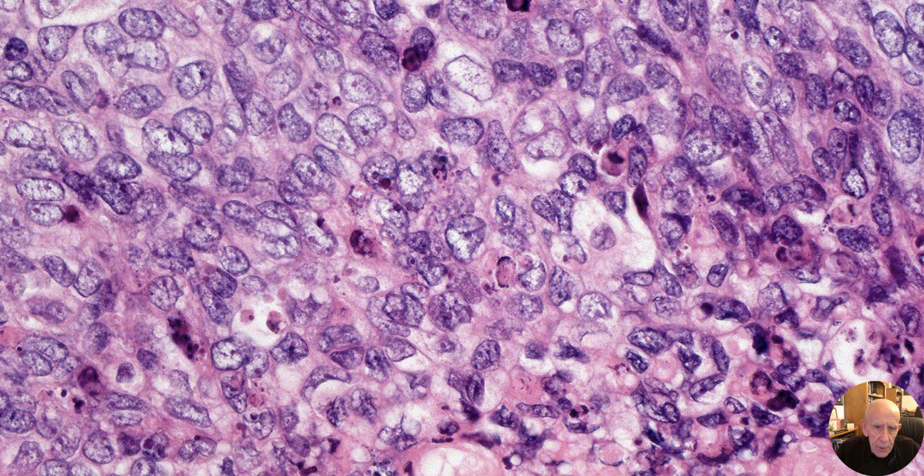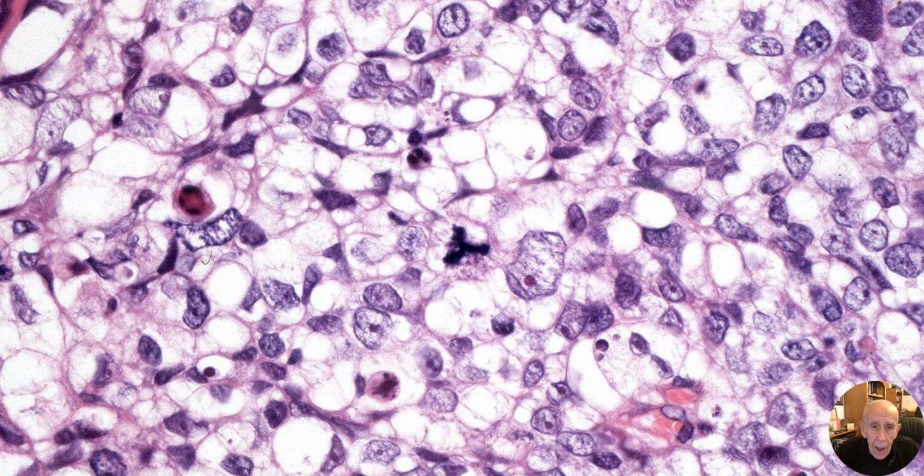And this field, what does this show? It shows lots of apoptosis and, well, that's about it. I suppose that there is nuclear pleomorphism and prominent nucleoli, and there is a field showing a tripolar mitotic figure. So that's a really good sebaceous carcinoma. Now, some people believe in grading these tumors, and others don't, and I tend to report them mostly as sebaceous carcinoma, but if I was going to grade this one, I think it would be very much high grade, and I'd be very concerned for the patient.